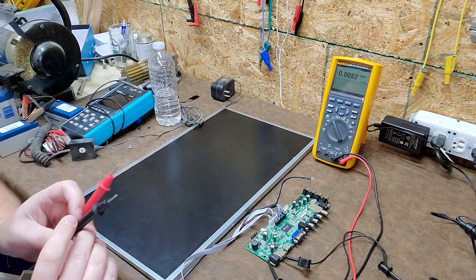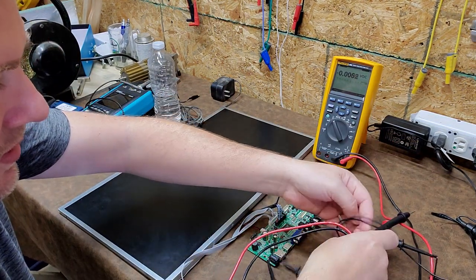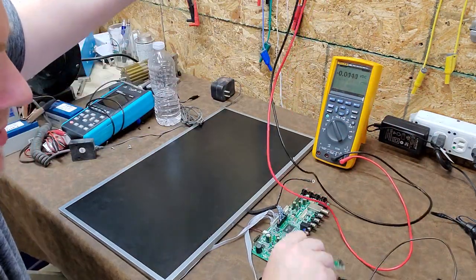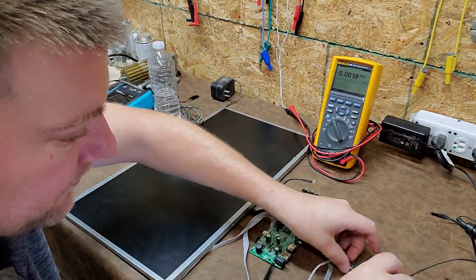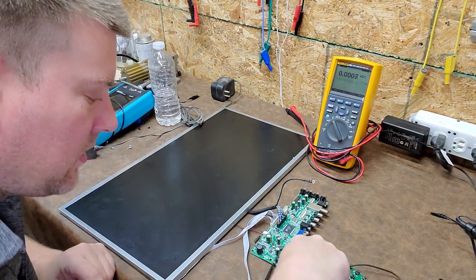There we go, we got our 12 volts. Okay, so I've got my 12 volts. Here, let me untangle this mess. Normally my workbench is a wee bit more organized, but I figured let me go ahead and show you guys this process real quick while I'm here. All right, and let me connect this guy back on the USB.